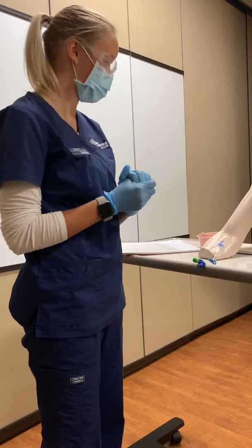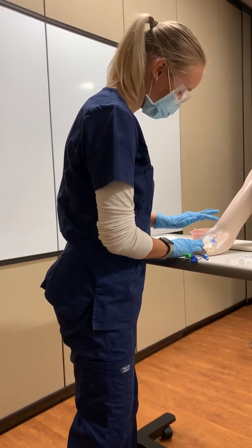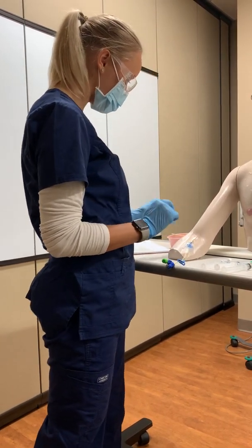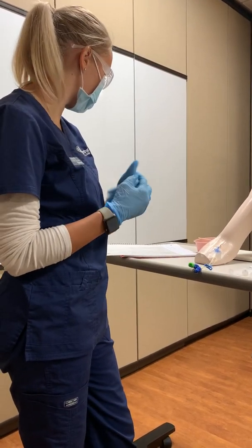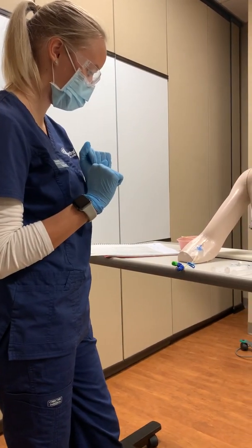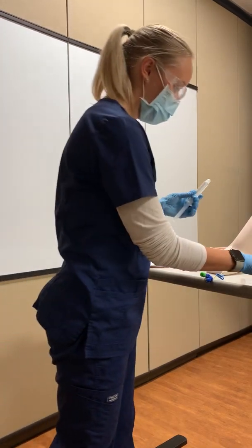She said no. Okay, so I'm going to wash my hands again and apply my gloves, and then I'm going to inspect the site for any infiltration, any redness, signs of infection, and she doesn't have anything. It all looks good. So I'll remove my gloves, wash my hands, and then put on my gloves again, and then we can start.